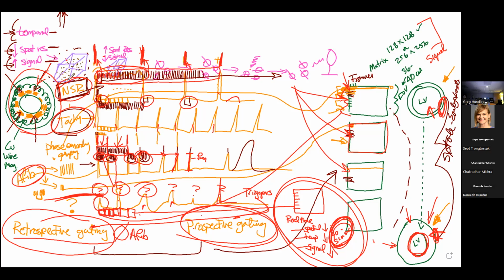Any questions? Yes. So when you talk about a PVC, instead of the regular rhythm, you can still find the triggers. But when you do the average, do you take the PVC out when you do the calculation? Yeah, what happens there is the information when the PVC occurs, see, it's going to see this is a trigger, and this is a trigger, and this is a trigger, and this is a trigger. It's not going to see that one. So it doesn't include it for you. So you're going to balance that with something like bigeminy. And you just run it once and see what you get. If it's still smudged, then you're probably going to have to switch down here to the real-time strategy. Good question.